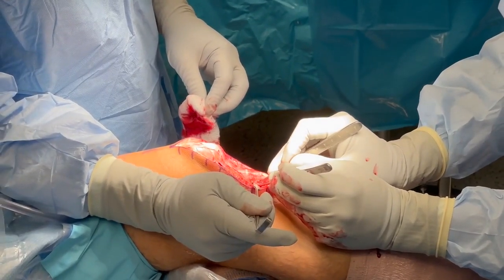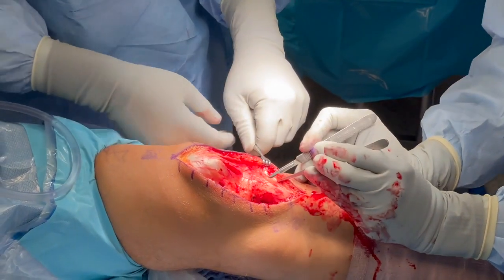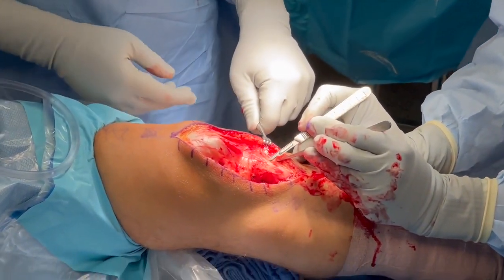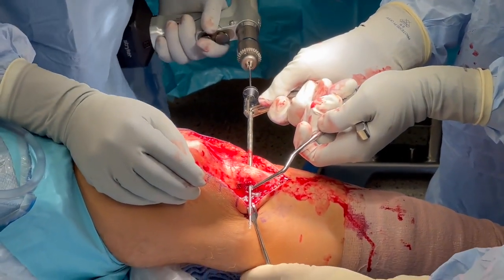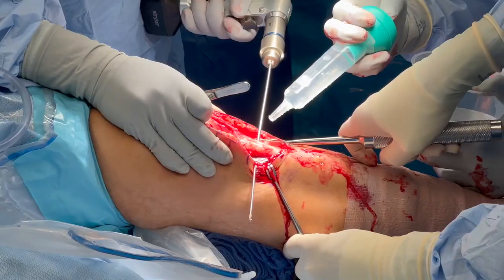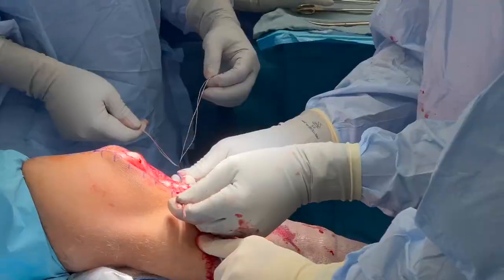Next, the location for the patellar tendon reconstruction tibial tubercle tunnel is identified. The periosteum was carefully elevated up at both sites on either side of the tibial tubercle. An ACL tibial guide was used to drill a guide pin horizontally across the tubercle. This was over-reamed with a 4.5 millimeter endo-button reamer and a passing stitch was placed.